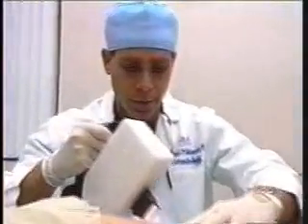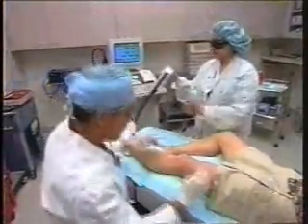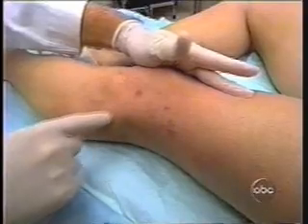California dermatologist Dr. Mitchell Goldman pioneered the use of a device called the Photoderm, now gaining popularity across the country. The Photoderm is not a laser, but an intense light source. We know that we can get rid of 90 to 95% of all the veins out there with traditional techniques of surgery and sclerotherapy. But there are so many patients that want their legs to be flawless. And the only way you can get them flawless is with these newer technologies like the Photoderm.